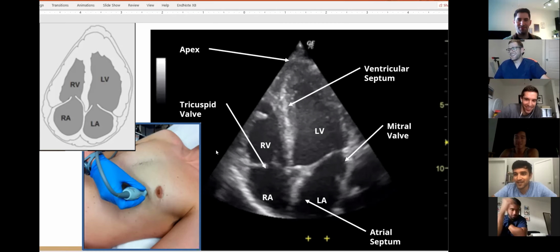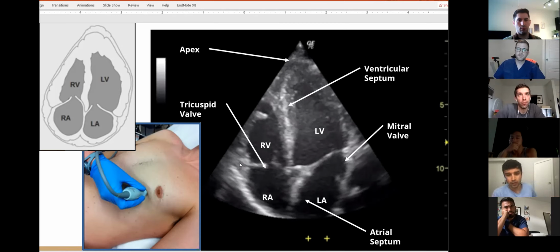That sounds right. So the right ventricle moves more in the anterior posterior direction, in this linear line, as opposed to the LV, which has 3 layers of muscle. And so one of the ways that we assess right ventricular function is how much it is moving in this direction. With M-mode, you can actually put a line across it and measure how much it's moving in each systolic cycle. But grossly, you can also just look and say, okay, is it moving a lot? Is it banging away, or is it just not moving? That's one of the other things that we use this view for, in addition to what Mark had said.